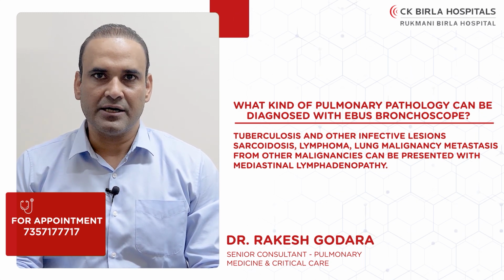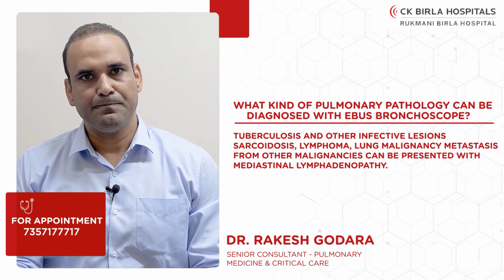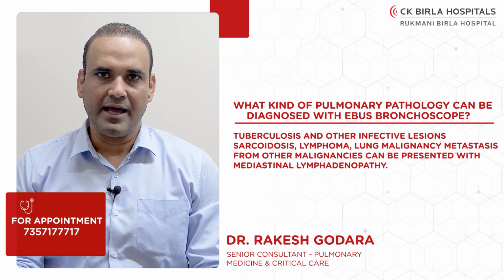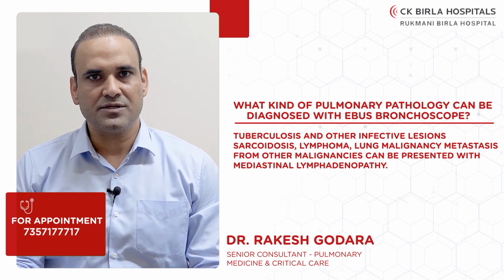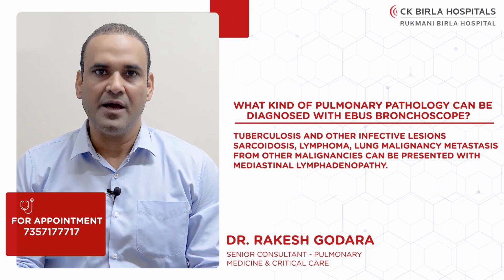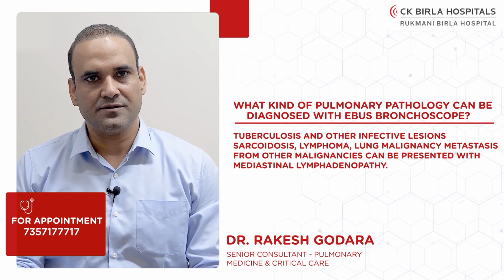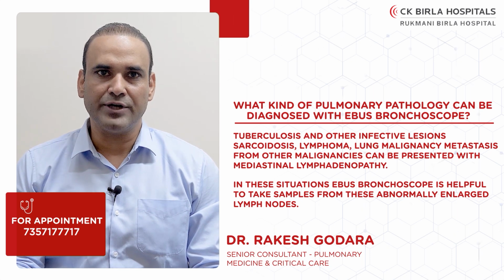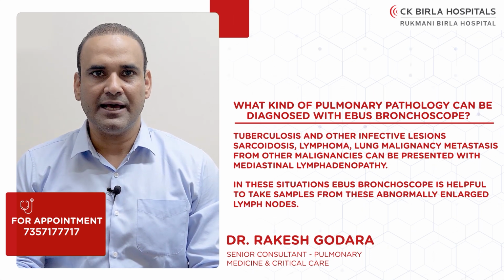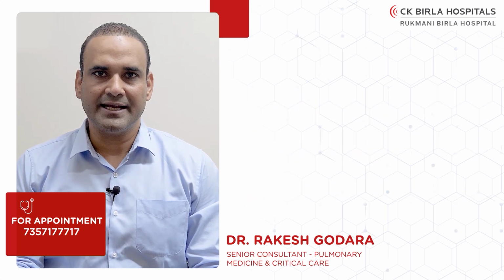As we encounter in our day-to-day practice, history and physical examination along with basic labs, including the chest x-ray and sometimes an advanced CT scan, will also not provide a definitive diagnosis in the majority of cases. In these situations, tissue sampling from these abnormal lymph nodes becomes necessary to make a definitive diagnosis. In these situations, the EBUS bronchoscope is very helpful to take samples from these abnormally enlarged lymph nodes or mass lesions. How is EBUS useful in malignancy?